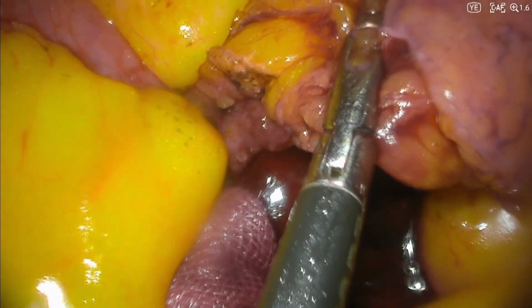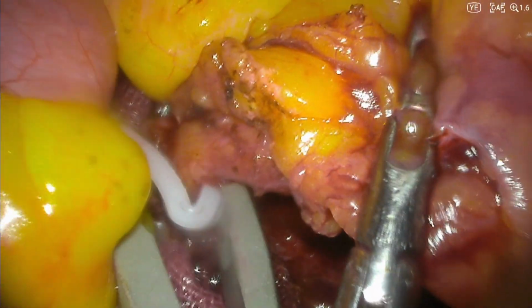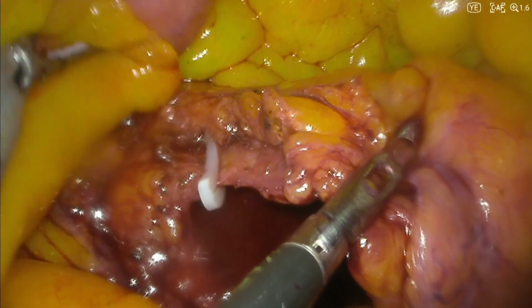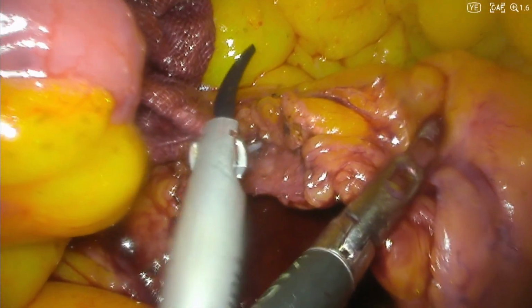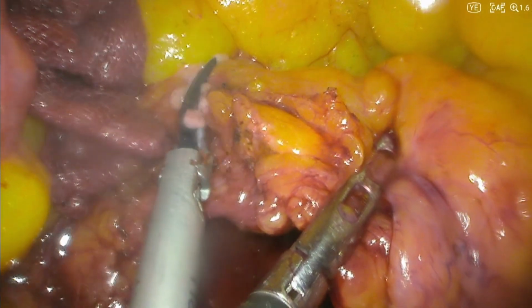The upper border of the inferior mesenteric artery is surrounded by fat tissue, and dissection of the region above the artery without causing injury to the artery was made significantly clearer with yellow enhancement, ensuring only the adipose tissue was dissected prior to clipping of the inferior mesenteric artery.